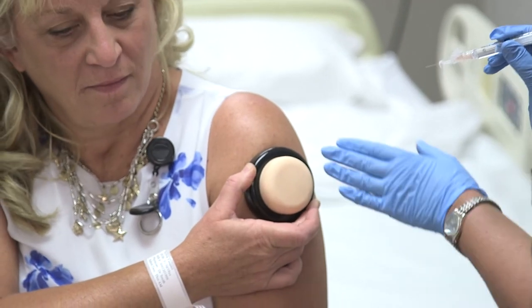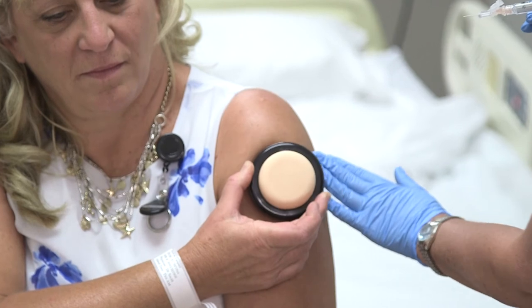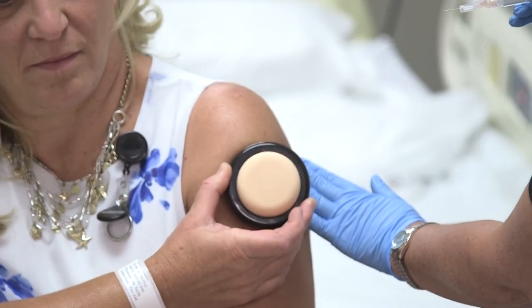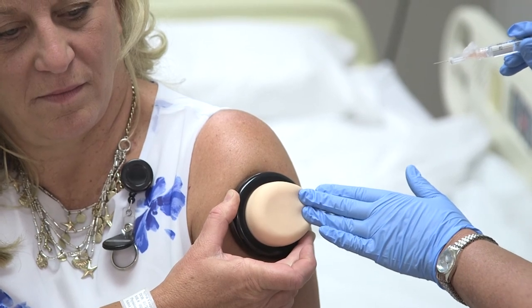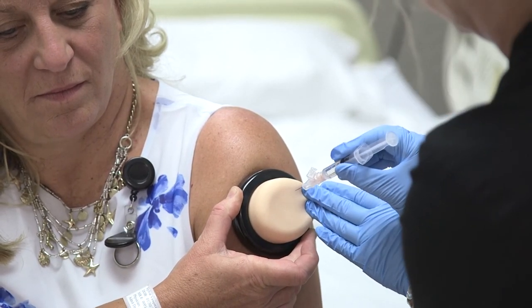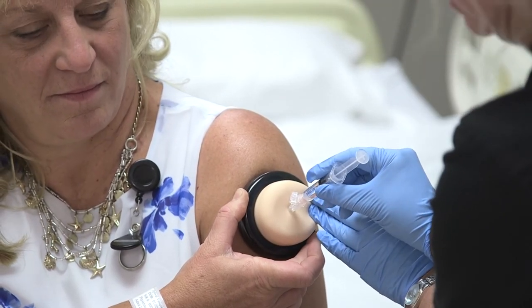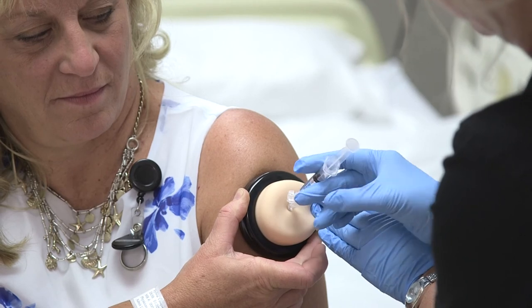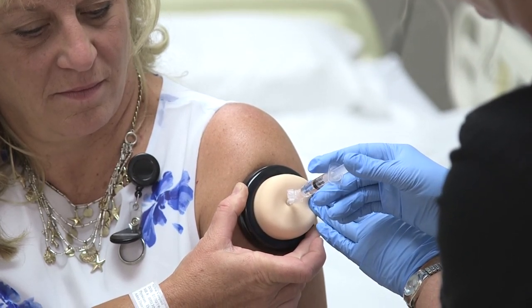All right, so if I were to give it Z-track, you'd want to pull the skin back. So if you want to get a zoom in on this, pull the skin back with one hand. Okay, or if you're doing this, you want to pull it back, hold it there. Okay. And then you're going to go ahead and you're going to shoot in like a dart. You're going to feel a little poke. Okay. So you're going to do that and you're going to keep holding the skin away. And then you're going to go ahead and inject nice and steady, not real slow, but at a steady rate.